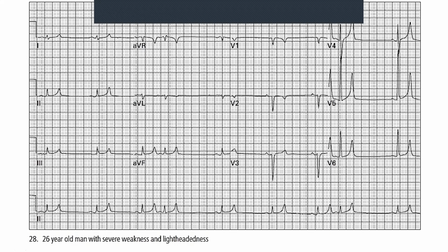Now let's go through our rhythm so that we know what's going on. The first thing that we look at is our P waves. One thing you'll notice is that the P waves are a little bit shallow, but they are still present. If you look at our PR interval, we look at the peak there, 1, 2, 2.5 to 3, so we're still within normal. That's our PR interval. Our QRS complexes are narrow, and then our groupings are quite regular.